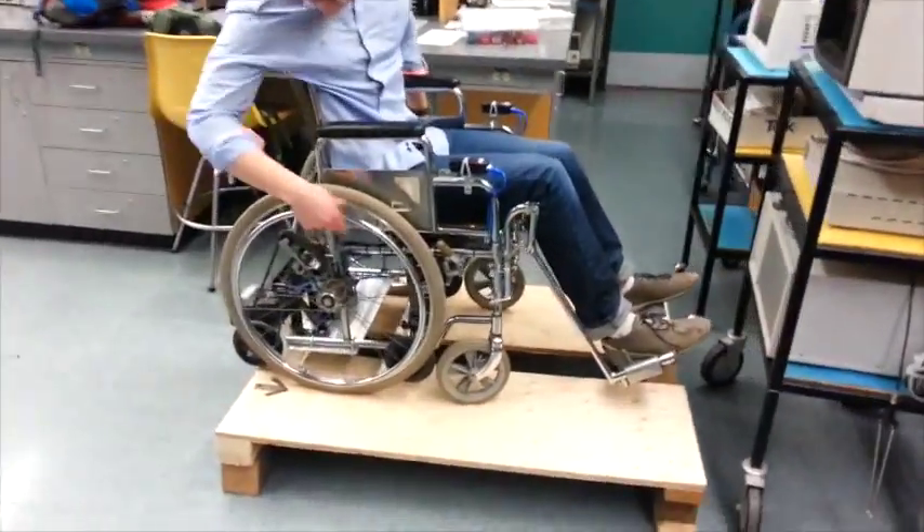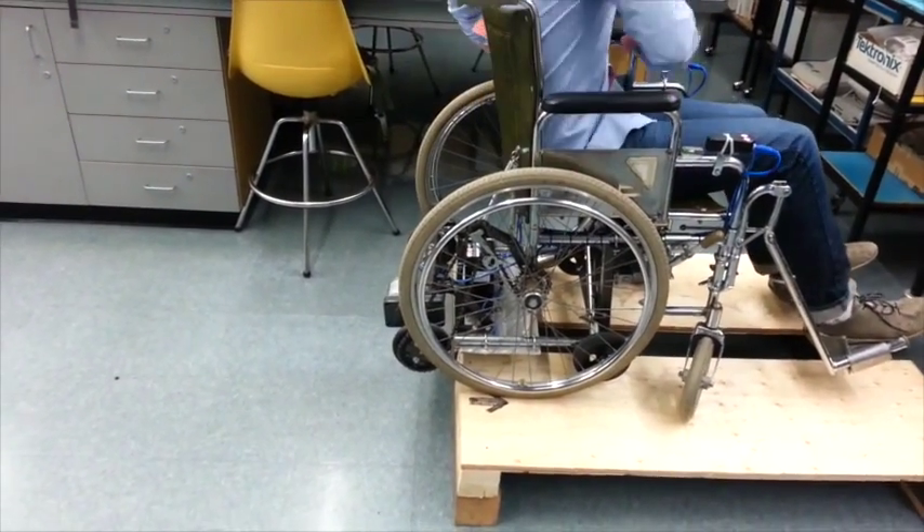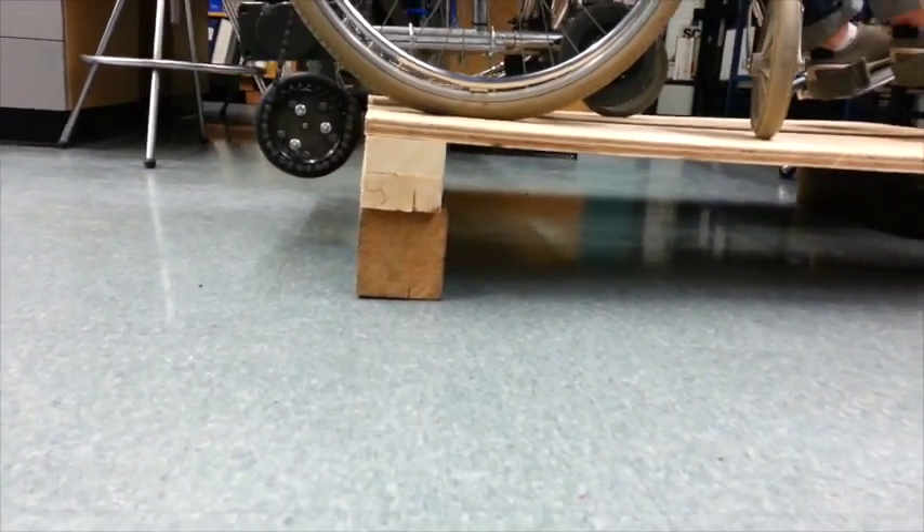To descend a curb, back the wheelchair up until the rear axle is past the edge of the curb. Apply the brake on the right wheel and hold the up switch for the rear axle until it is all the way down to the ground.